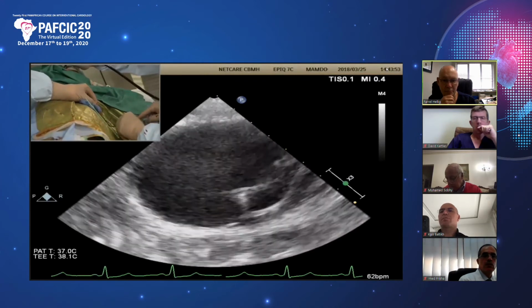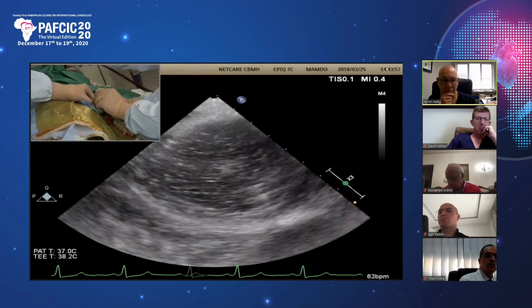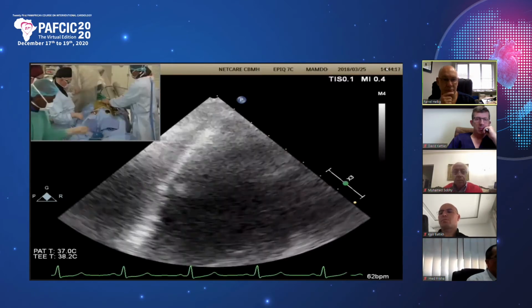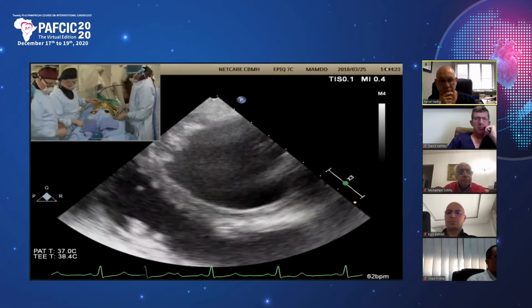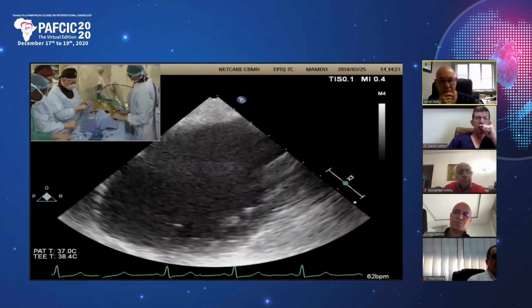There we go. And then flush. Okay, so now we can remove the wire, the sheath in the ventricle. Can we switch to? And I'm going to come back around the other side and ask Shaheen to come here. Now we're going to be crossing retrograde, and then we will close antegrade with an exteriorized rail to offer us directional support.